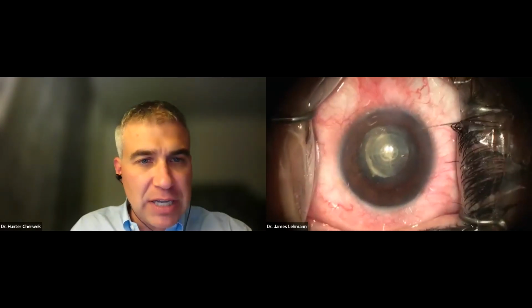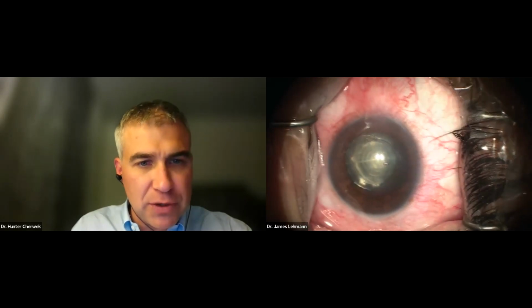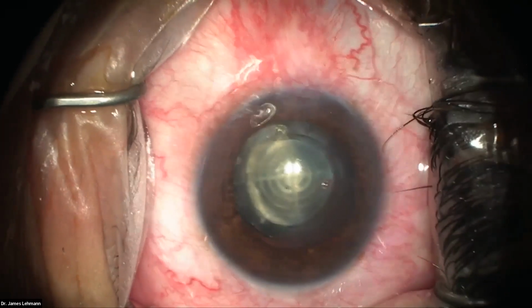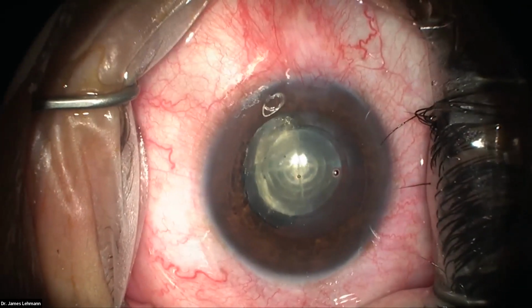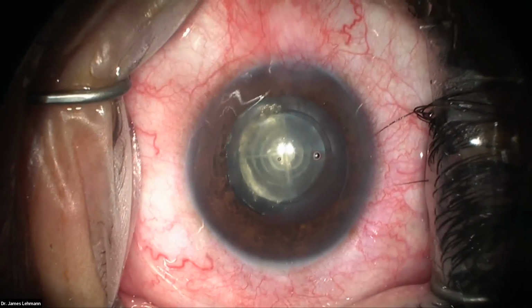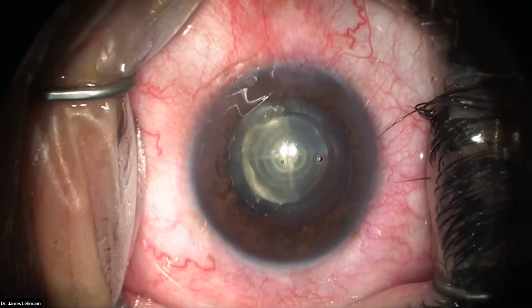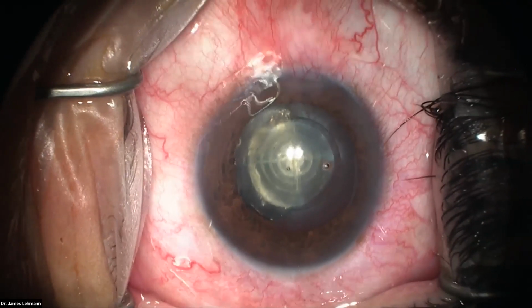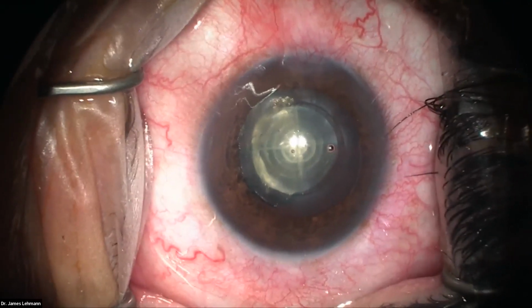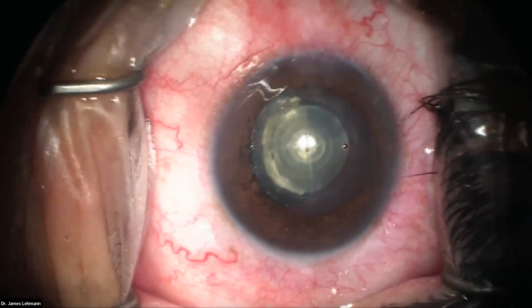Dr. Lehmann, I see you've got this next patient ready. We're in perfect focus. Okay. Can you hear us okay? Yeah, I can hear you. Can everybody hear me? Loud and clear, sir. I may speak in Spanish a little bit. The patient's Spanish speaking. I'm just going to ask how he's doing and if everything's okay. All right. So, señor Martinez, ¿está bien? Ok, vamos a empezar. Usted va a oírme que estoy hablando con la gente, pero dígame si tiene algunos problemas. ¿Está bien? All right, guys.